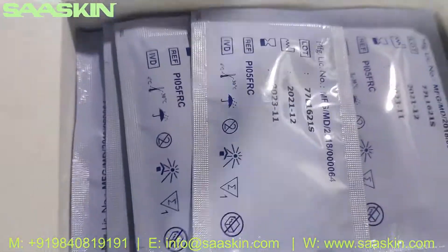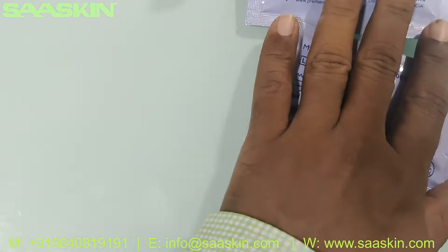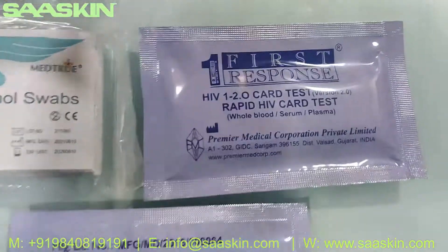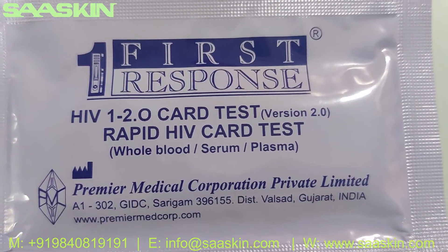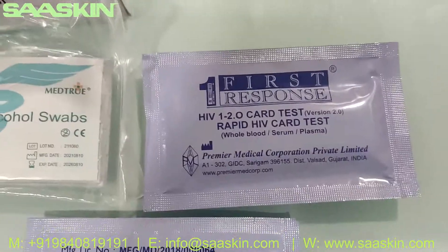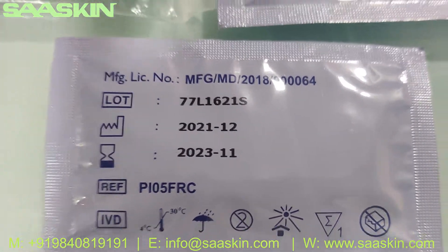Further inside the box you have 30 test cassettes, individually packed. You can see the test cassettes — First Response HIV 1 and 2 antibody card test. Basically this is a WHO-approved kit, which is the key feature here. On the other side of the cassette you can see the two-year validity period.